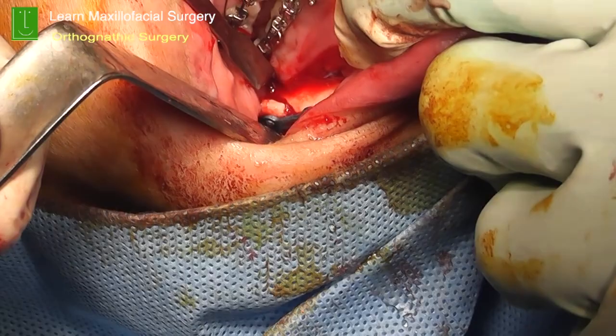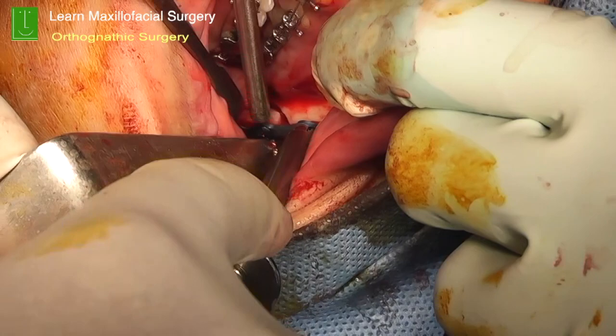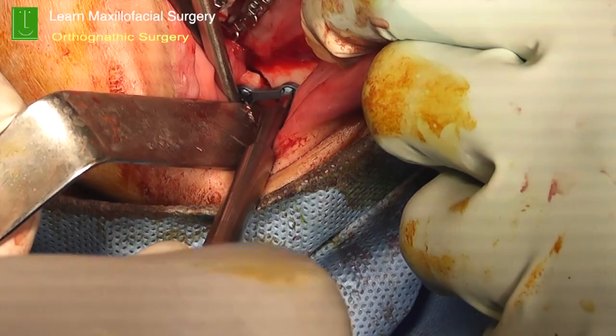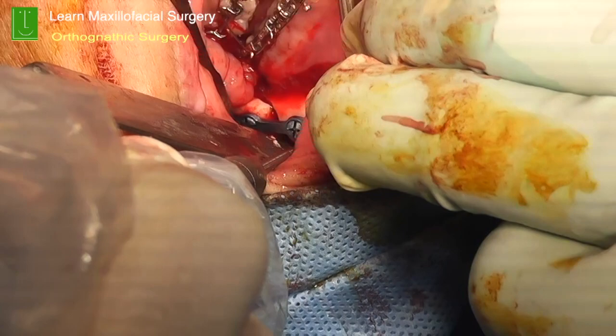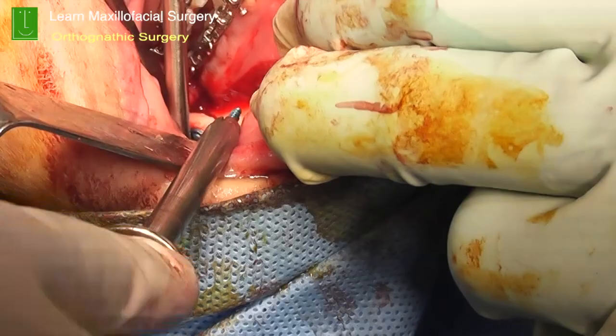So you can see the way in which the mandible osteotomy is now fixed, very nicely adapted. Both the osteotomy cuts are very beautifully positioned, and two screws on either side of the osteotomy should be good enough to fix the bone. The front screw is being placed, and 2x8 mm screws are being used to fix the plate.